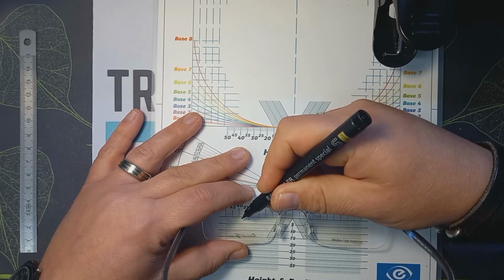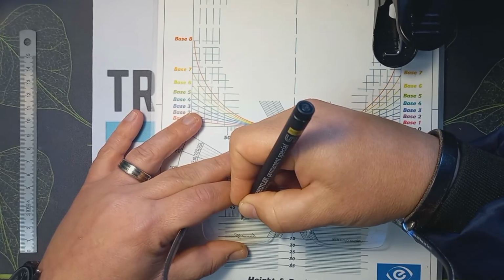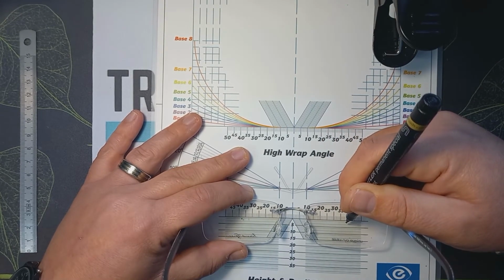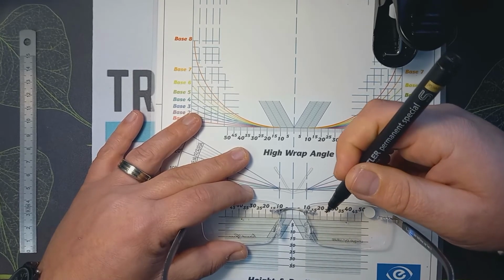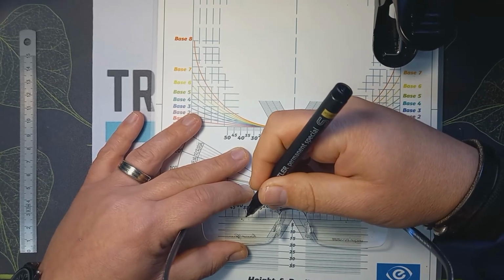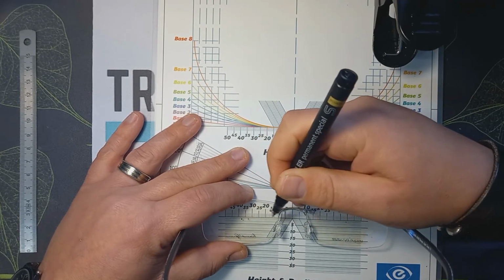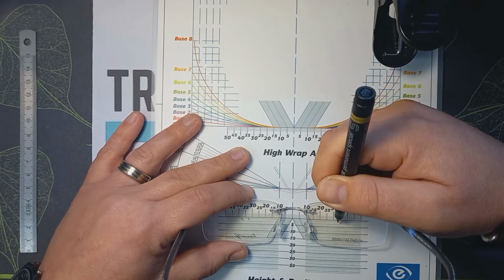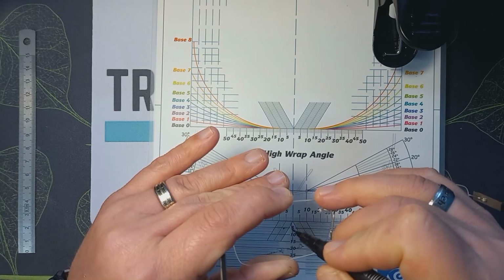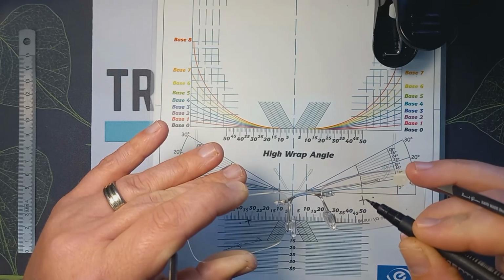Okay, there we go. 37.5. And our patient PD, 65 divided by 2 just to get a mono PD, is 32.5 there, and then 32.5 there. I like to make a cross where my patient's pupil will be, which is then the patient's PD. Cool, there we go.